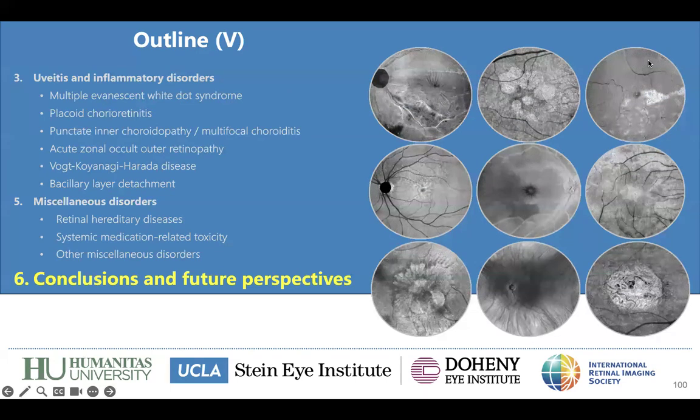Well, Alessandro, it's kind of breathtaking imaging, and I love retina imaging. You are aware of it, and these are really, really great. I have a question for you.